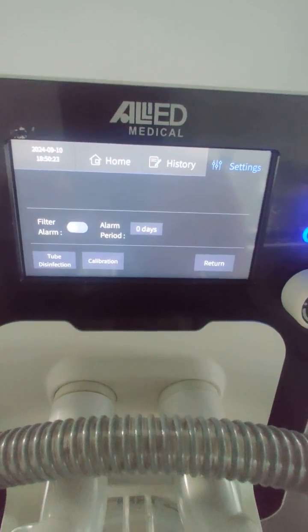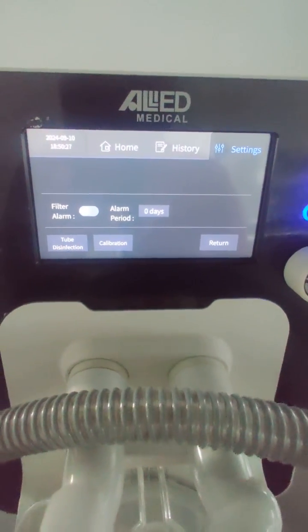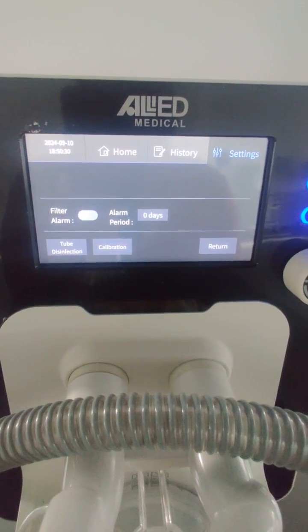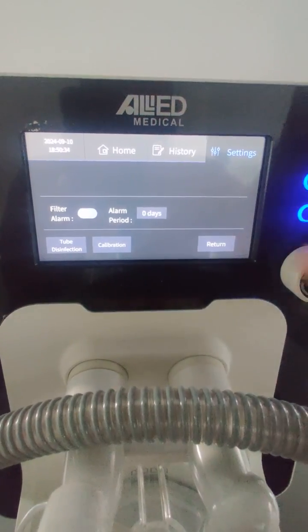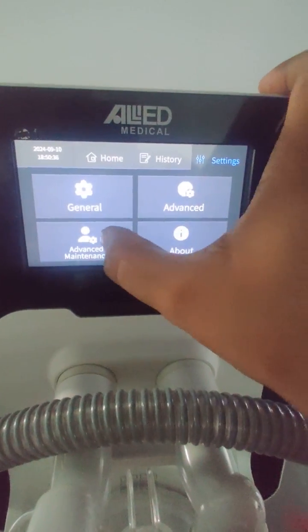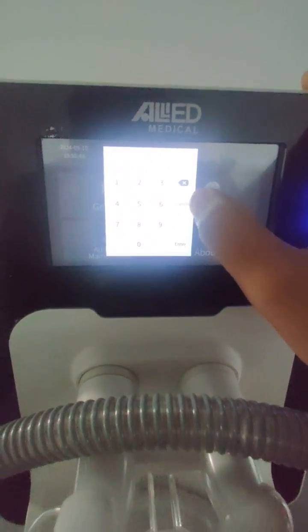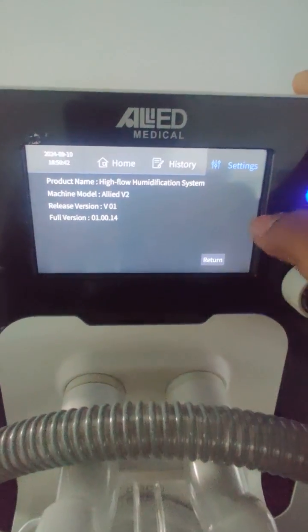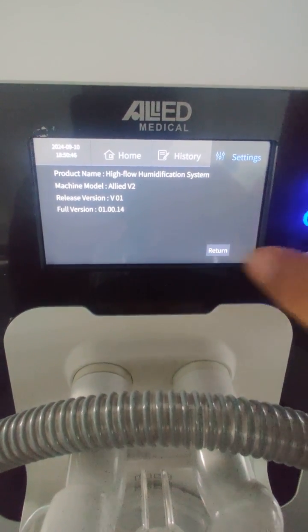In advanced mode you can calibrate the oxygen sensors. There is also a tube disinfection option — an automatic tube disinfection feature that prevents cross-contamination by sterilizing the tubing. The advanced maintenance setting is used by service personnel, and you can also view device information such as firmware version and release version.